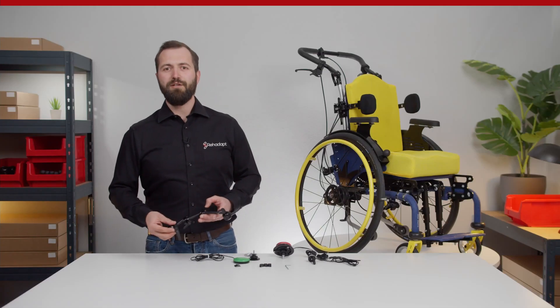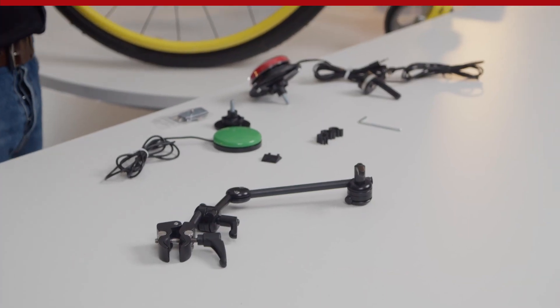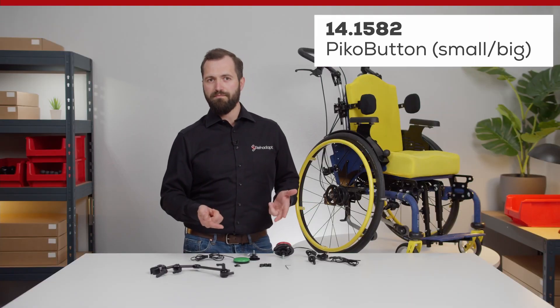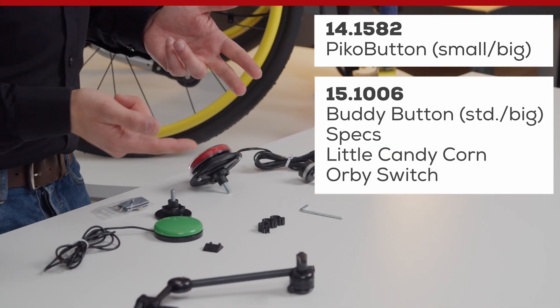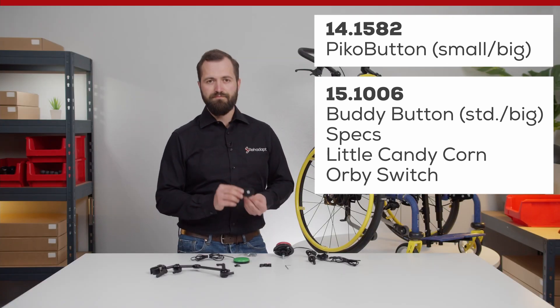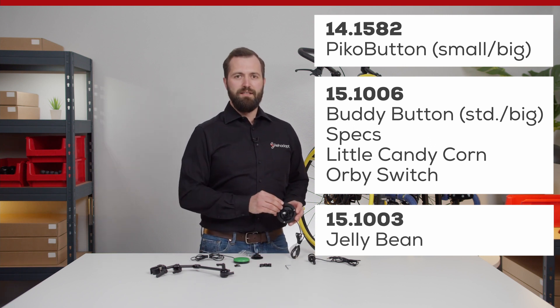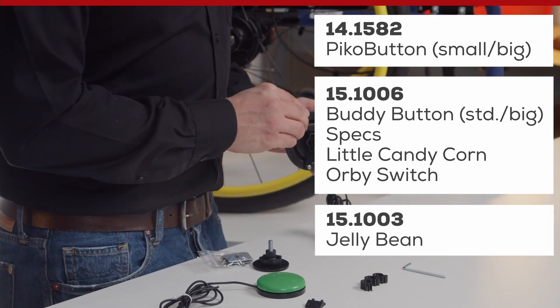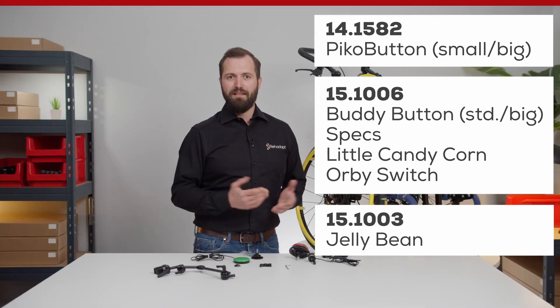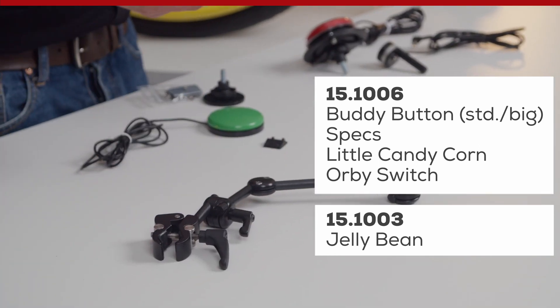The kit also includes adapters for the most common switches, like the L3D GA Pico button adapter for the small and the big Picos, the MA Buddy Specs Little Candy Corn and Orbi Switch, and the MA Ablenet Jellybean adapter plate. We also included three cable clips that allow you to keep the cable of the switch neatly organized along the tubes.